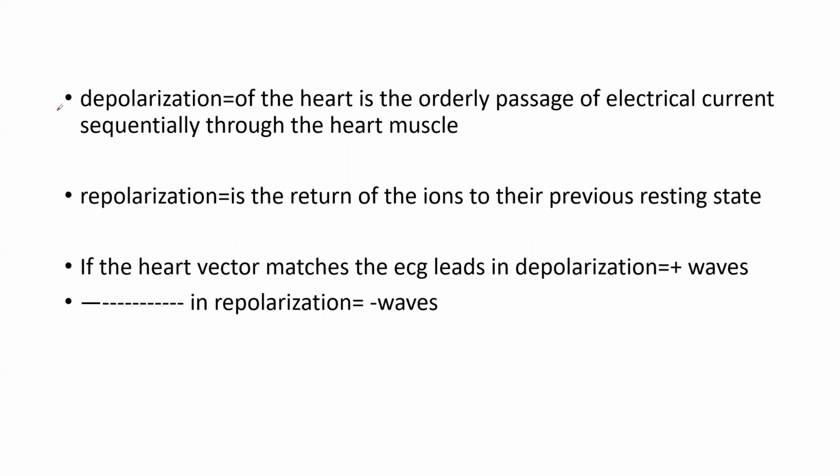Before that, we should know about these two things which happen over and over while the heart is working, depolarization and repolarization. Now we will know how to write either a positive wave or a negative wave. Let's take, for example, one axis right here, and this will be for all the axes.